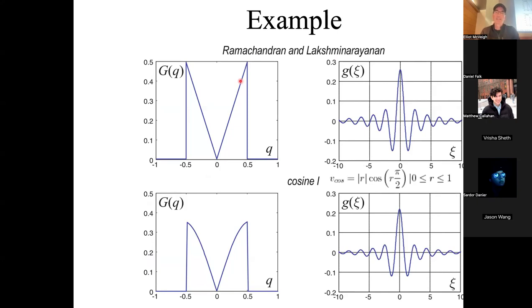In applying that convolution of this function here, Ramachandran and Lakshmi Narayanan came up with this technique of doing this convolution back projection, right?